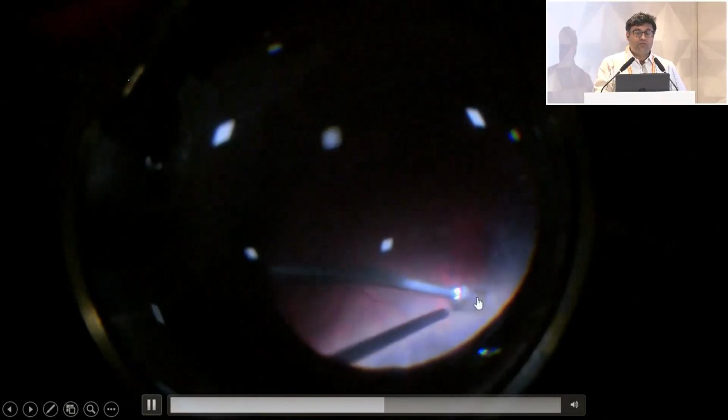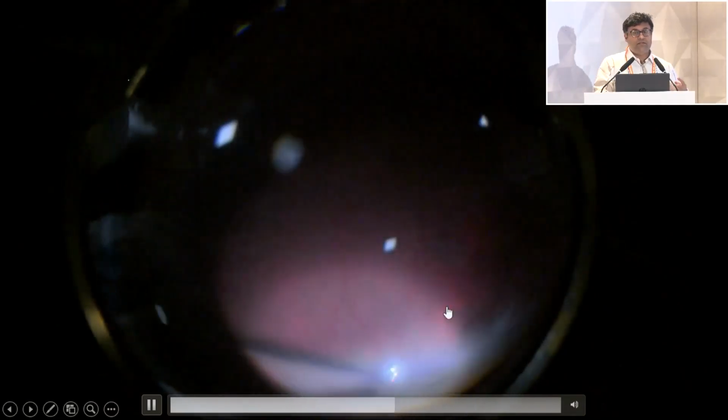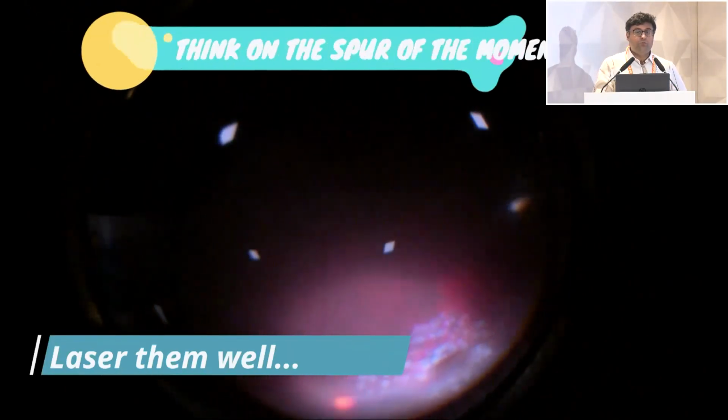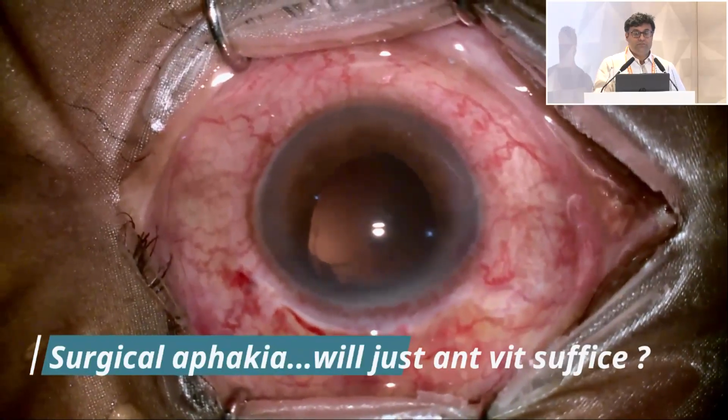You would have had an iatrogenic break. You see a break actually developing when I'm trying to tackle the vitreous in the posterior chamber. This would have happened naturally as a result of PVD later on, and the patient would have landed up with a detachment. So you'd have had to keep the patient on a very close follow-up postoperatively to look for retinal tears, but it is much easier to manage the posterior vitreous, especially if you are a VR surgeon, in the same setting itself.